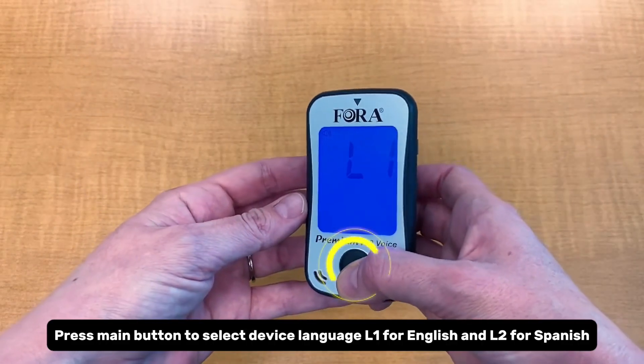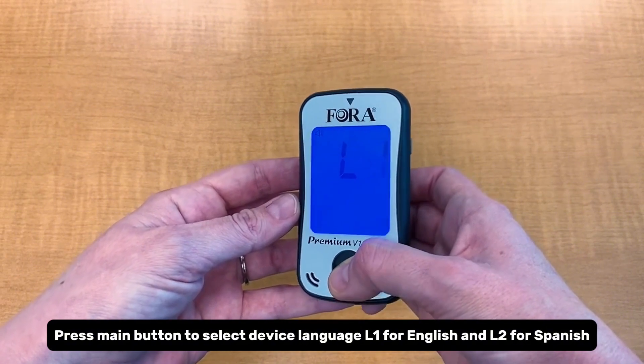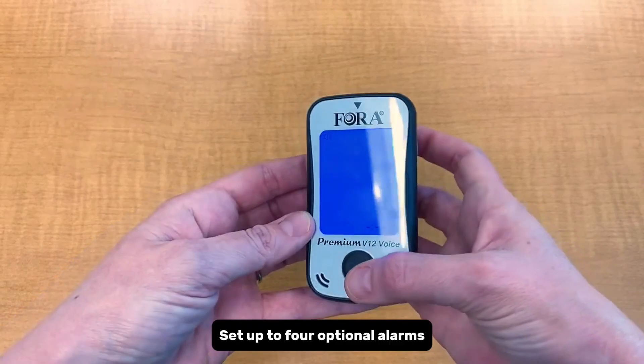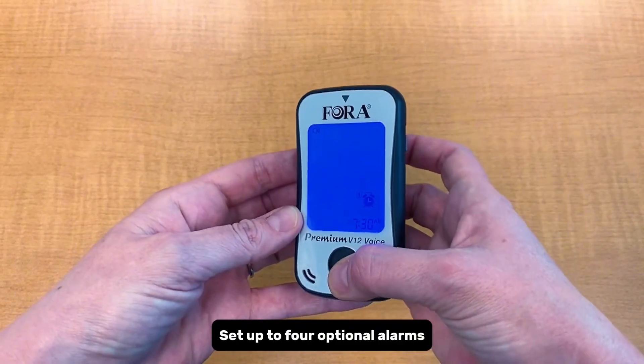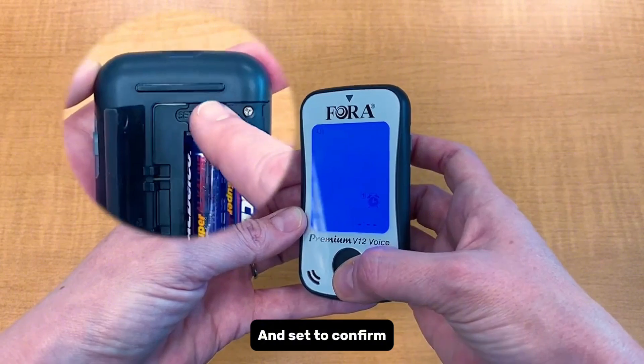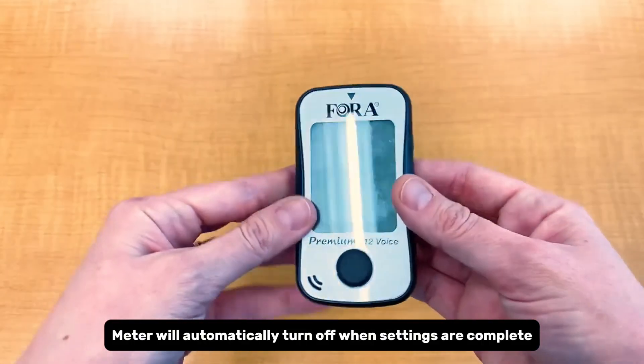Press the main button to select device language: L1 for English and L2 for Spanish, then press set to confirm. Set up to four optional alarms by pressing the main button to switch an alarm on or off, then press set to confirm. The meter will automatically turn off when settings are complete.